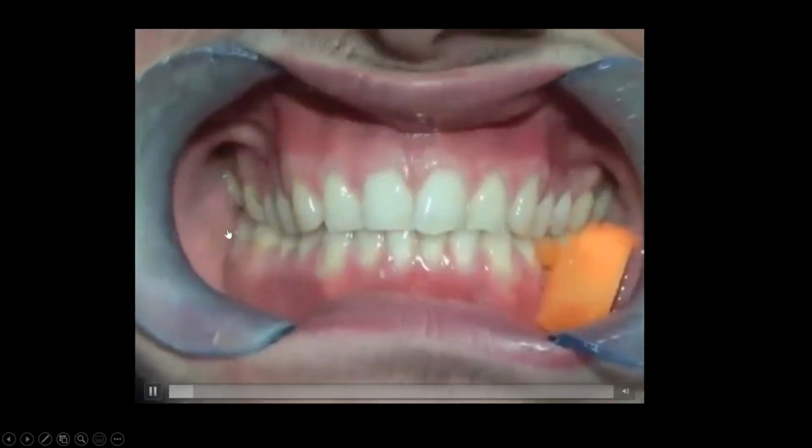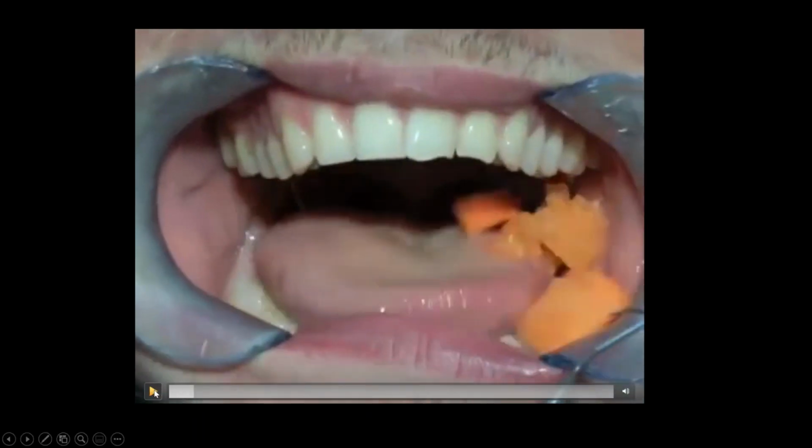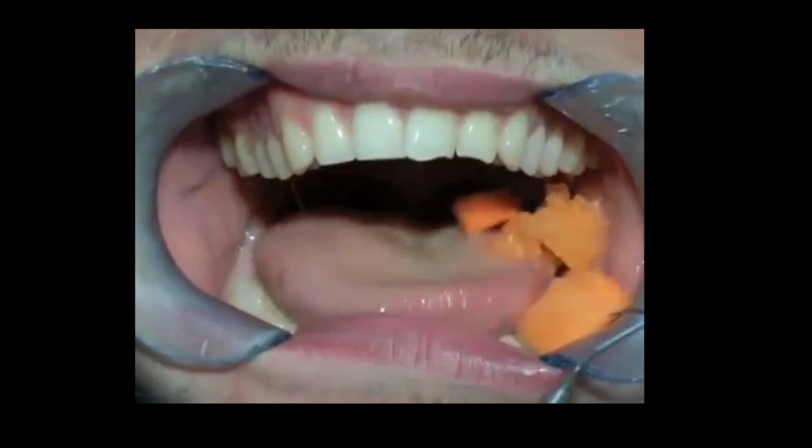So I'm going to pause the video for a minute. So when I first started, we were taught to look at midline, smile line, the color, the triangles, things that you see in the mouth on a wax try-in. And we would look at the aesthetics of it. No one ever taught me to look at the future function of it. What's their chew cycle going to do? What does it look like? How does it function so that I can set the teeth better within their chew cycle so that I don't run into the problems and keep banging my head on the wall? So how do you identify that?